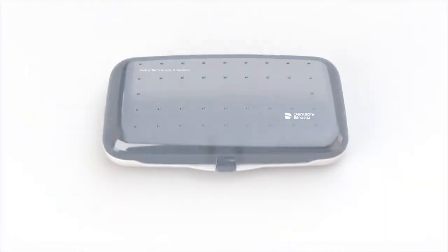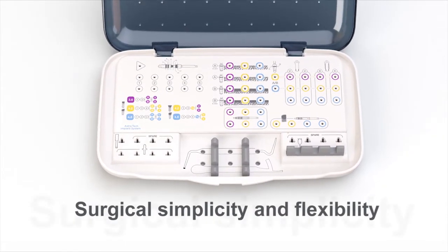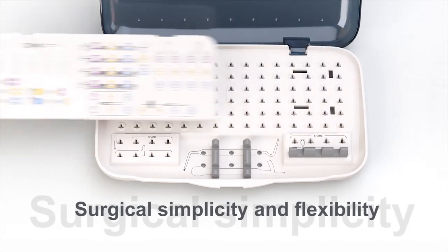Some procedures are now more predictable — we have fewer possibilities for technical mistakes. It goes quicker, and if you work quicker and safer, it's more pleasant. The versatile implant designs are supported by just one surgical tray with an intuitive layout for effective handling throughout the surgical procedure.